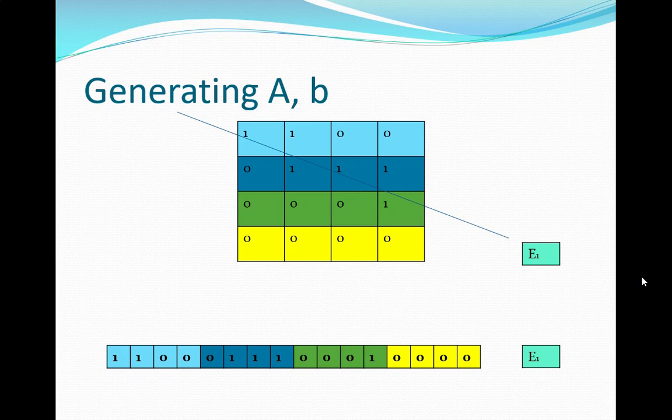In our case, all of our voxels are 1 millimeter, and we assume it went straight through, so we're assuming a length of 1. That's most likely true when it's coming in straight on. When it's coming in at an angle, it could be as much as 1.4, or it could be just nicking the corner.